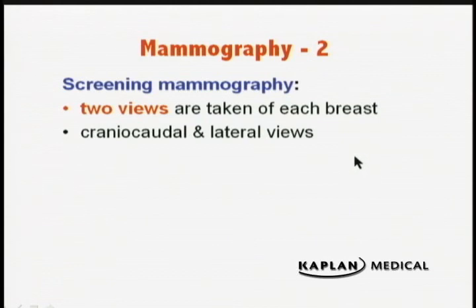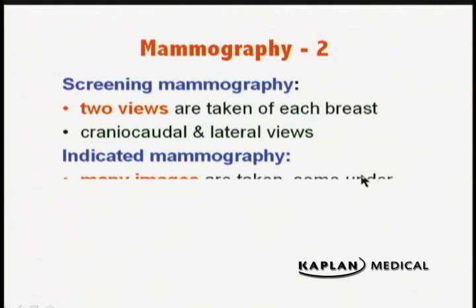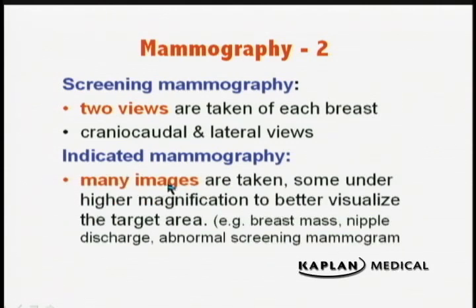If it is a diagnostic mammography, you may take many images, depending on what you're looking for, some under higher magnification to better visualize the target area, and the radiologist will often use a magnifying glass to better assess for any calcifications, for any abnormal areas, particularly when you're comparing previous and new images. This is done if you have a breast mass, nipple discharge, or an abnormal screening mammogram.